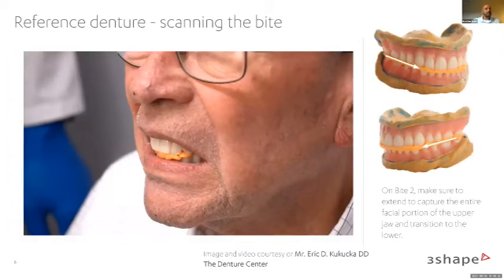The last step is the bite scan. Because you do have teeth information on these reference dentures, there's no need to do a bite rim scan or a centric tray scan. You can just do buccal bite shots of the dentures themselves. You'll put the dentures back in the mouth, now that they have the nice wash impressions in them so they fit really well. You'll take just a regular blue bite of the patient in between if they need to open the vertical. Then you'll scan that blue bite in between the dentures, and that gives you your new vertical dimensions.